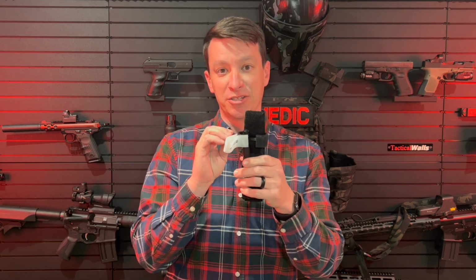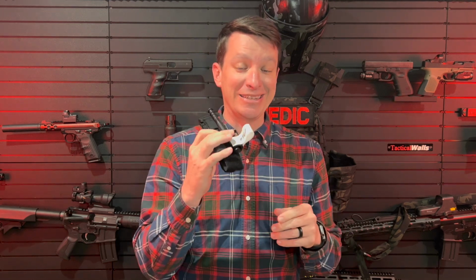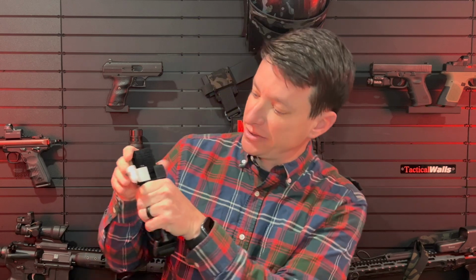So we'll take a look at this one a little bit close up and let you know how I saw right off the bat that I thought this was a fake. I've practiced with this one and it does not tighten up very well. You make turns, and it does not tighten up enough to actually make it a tourniquet. So when I saw this one in a pouch, all I saw was basically this part right here sticking out, and I was like, huh, that's interesting.